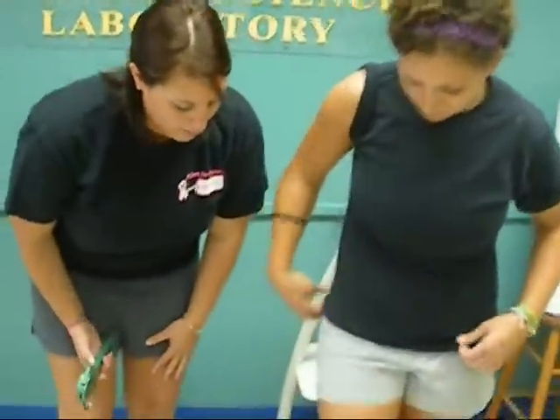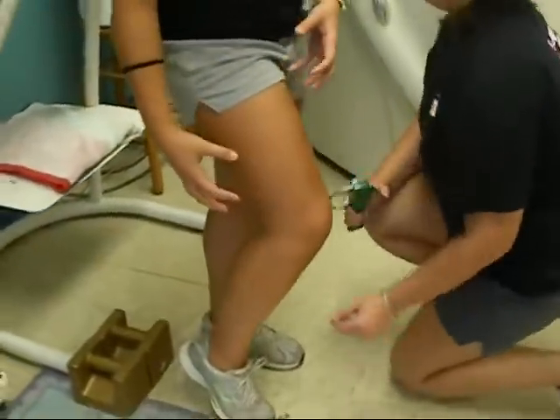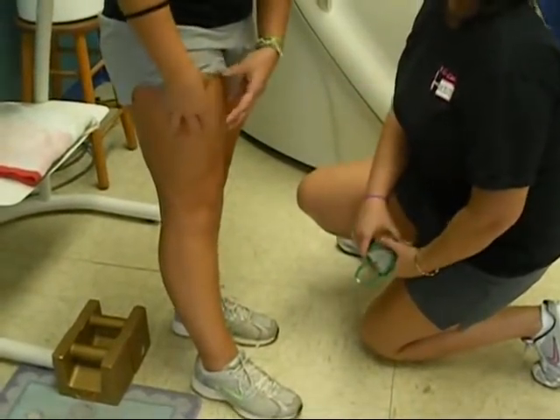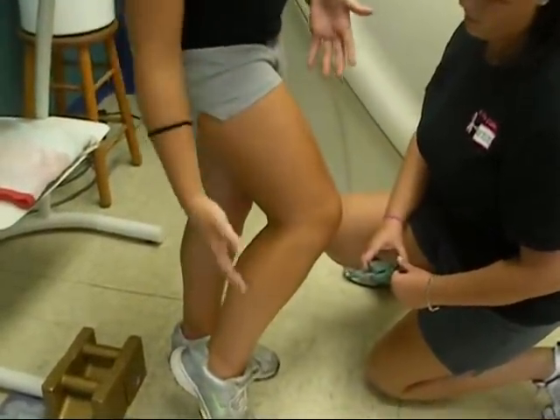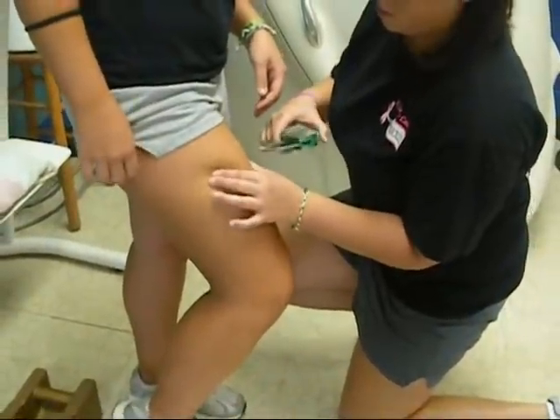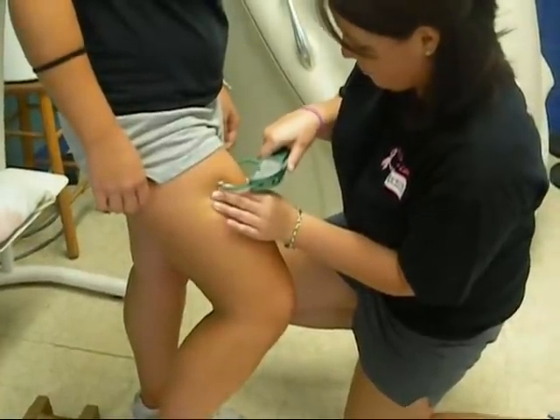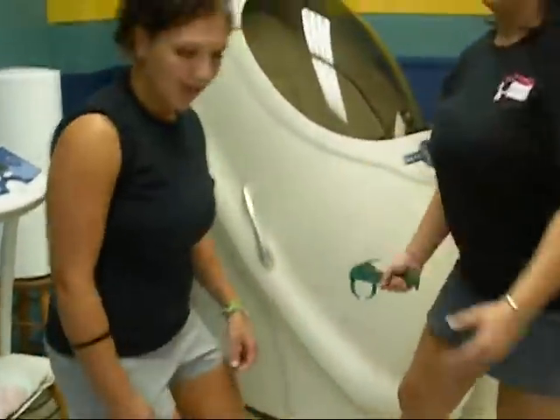Then you're going to move to the thigh. You want to make sure that you relax your leg, because if your leg is tense, there will be more muscle and it will be tighter and she won't be able to grab the fat. So you want to make sure to use plantar flexion of the foot, and then she's going to go ahead and gather the fat and measure it. Separate it, grab it, read it, and then let go. And that is the three-site skinfold test for females.